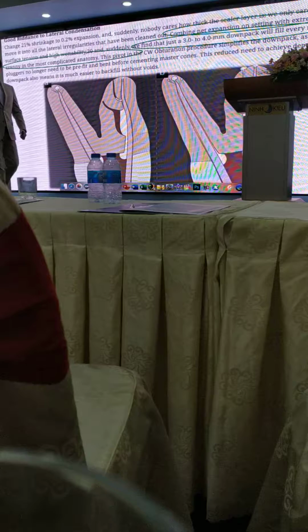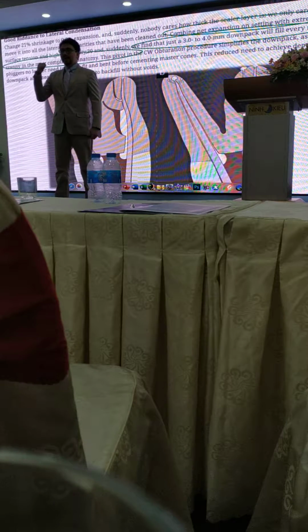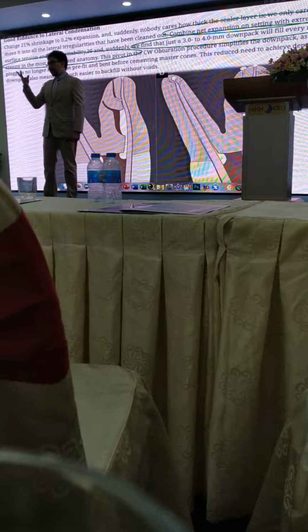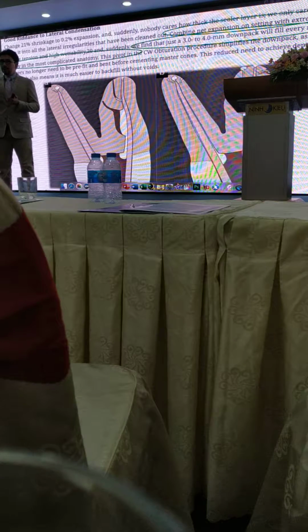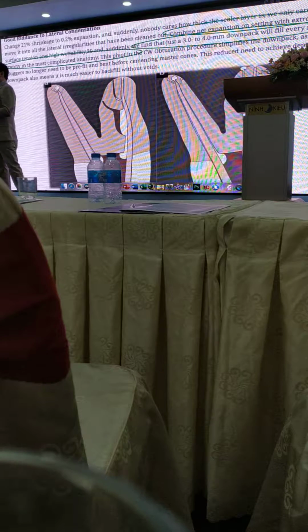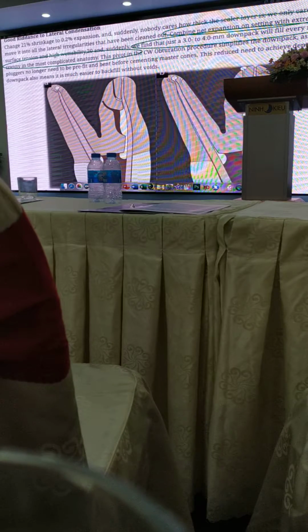What can you do for filling the coronal area of this root canal system? You can do 2 things. 1, proceed with the gutta-percha injection, or 2, proceed to inject the bioceramic sealer. In the way you want, you can proceed, and you will obtain good results.